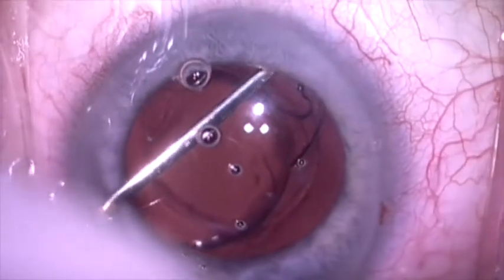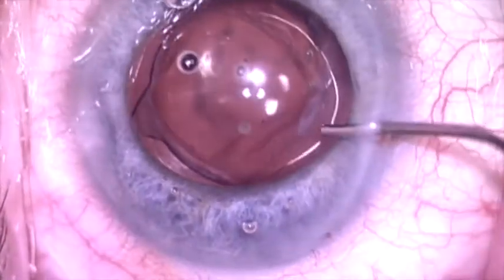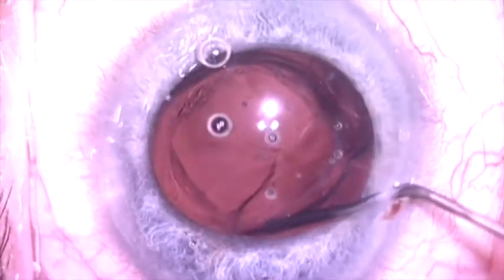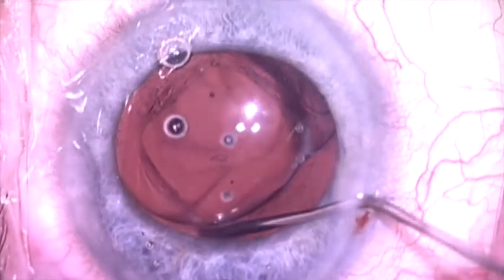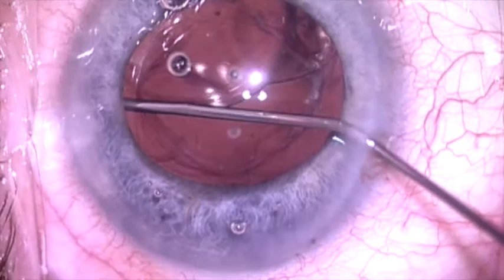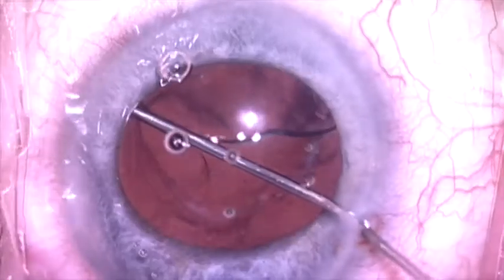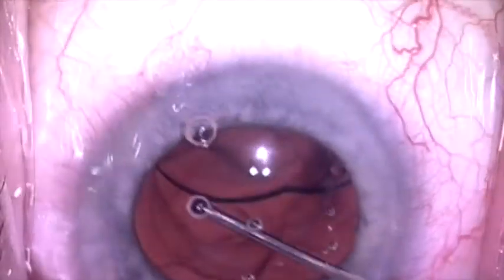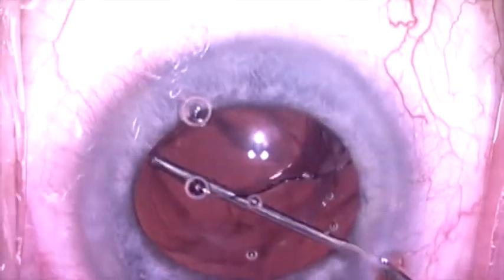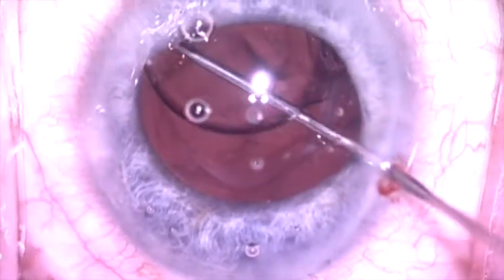There is some fibrosis here, but I'm able to start the process of reopening this rim of capsule. You don't really have the normal backboard that you have to dissect because the capsulotomy opening prevents us from dilating the capsular bag as we normally would. But we can sneak under the anterior capsule rim here, and here I am behind the implant, sweeping to the side to dissect the anterior and posterior capsule from each other, as you see here, creating a potential space.